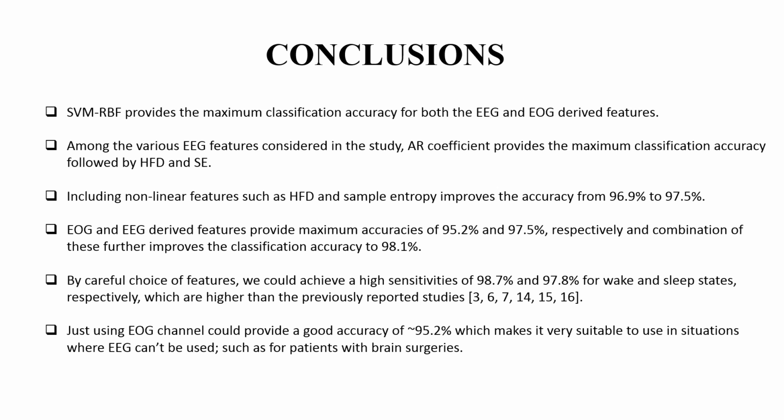And just by using the EOG channel, we could achieve an accuracy of about 95.2%, which makes it very suitable to use in situations where EEG can't be used. For example, patients with brain surgeries who are in coma, in those situations, we can just avoid EEG and use EOG.